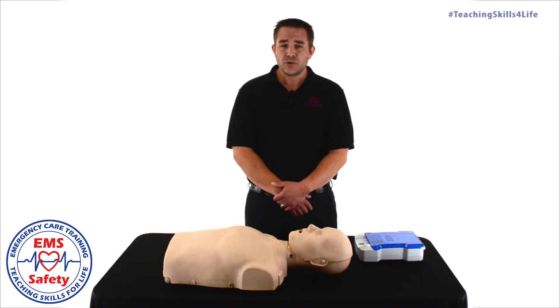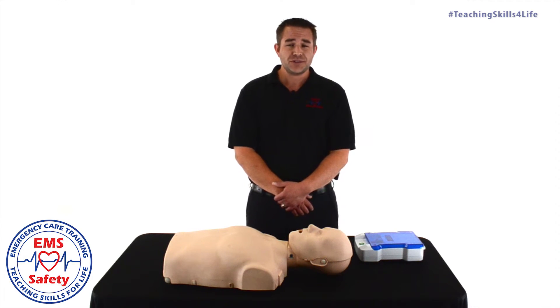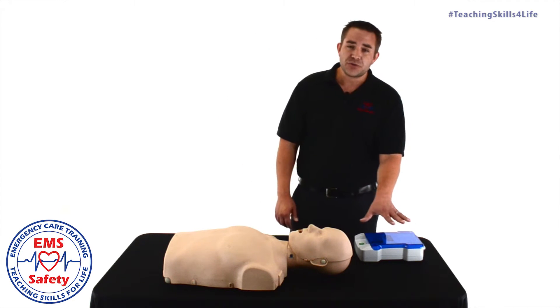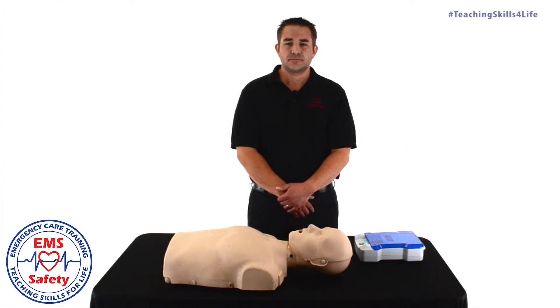It is important to follow those prompts closely. The AED is going to tell you exactly what to do and when to do it. You do need to place that AED near the victim's head and power it on. Remove clothing from the patient's chest. Open the packet and apply pads onto the patient's bare skin. Apply pads as shown in the pictures.